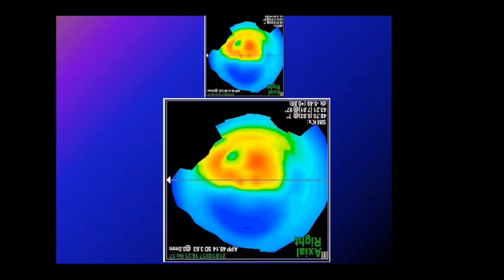Dr. Sami, would you please repeat the last slide, because your connection was lost. So when you reach the stroma, the spots will become black. Yes, once you finish with the epithelium, what is under the epithelium is stroma. So once you reach the stroma, it gets black in color because the stroma does not fluoresce.